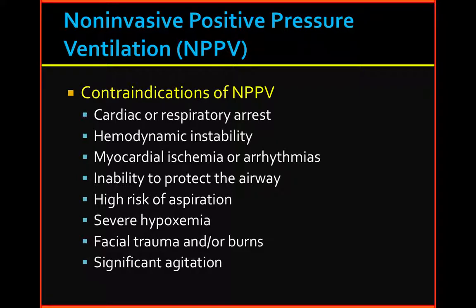Ventilation modes mostly differ in the way your minute ventilation, or tidal volume times respiratory rate, is delivered to the patient. Regardless of the mode of ventilation, adjustments of FiO2 and PEEP are the same. There are controlled modes of ventilation, hybrid modes of ventilation, and spontaneous modes of ventilation. For controlled and hybrid types, there are two large categories of ventilator mode: modes where we set the patient's tidal volume, known as volume control modes, and modes where we set an inspiratory pressure, known as pressure control modes.